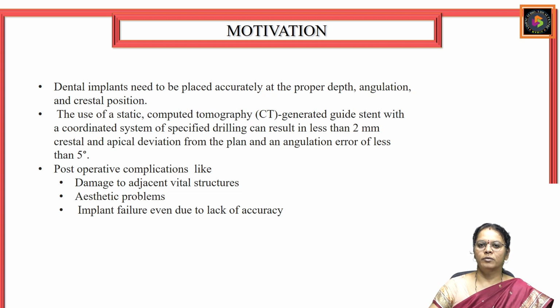Use of static computed tomography based technique was already implemented in various surgeries and implantations. But the advantages with this would be that it provides less than 2 mm of crestal and apical deviation, and also provides pre-operative planning which will minimize the angulation error to less than 5 degrees.